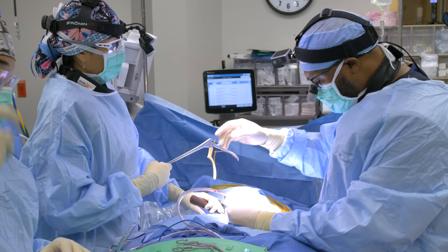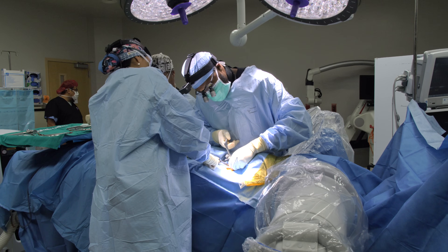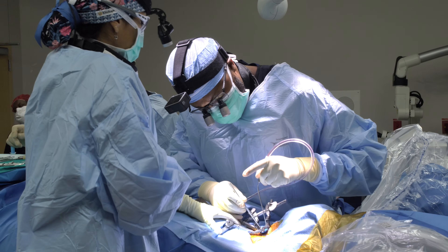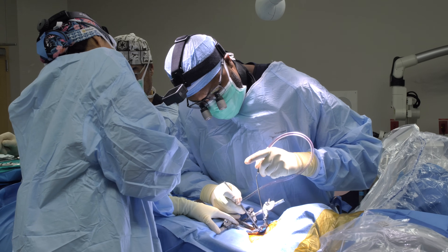Nerve hook. His MRI showed that he had pretty severe nerve compression on his left side over here, which he does. I'm just making more space for that nerve right now. Right now I'm just checking to make sure my decompression is thorough and adequate.